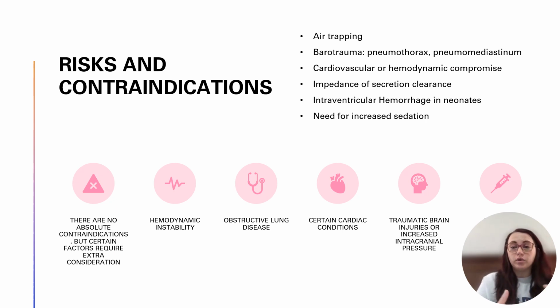In the NICU I work in, we do still do kangaroo care and holding with our intubated oscillating babies as long as they're stable. It just takes a little bit more work from the clinical team to be able to do that, but we found that there is still a benefit to holding these babies if we can reduce the amount of disconnections that happen from the oscillator.